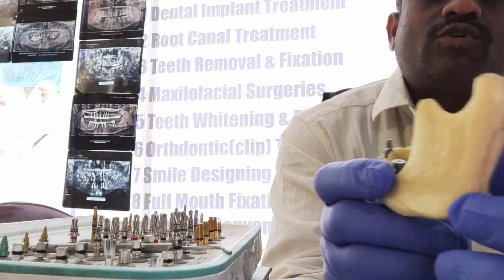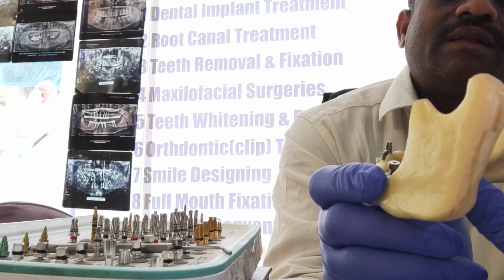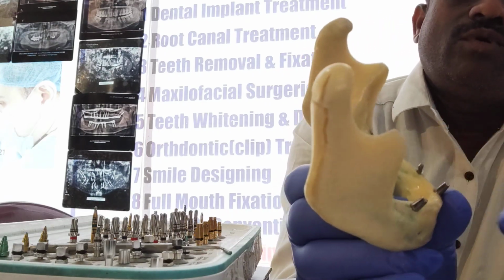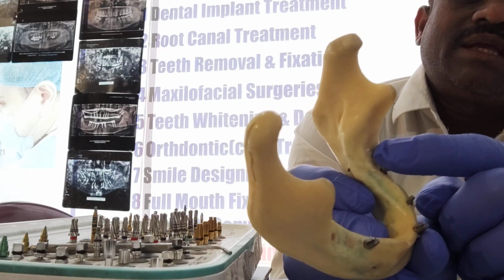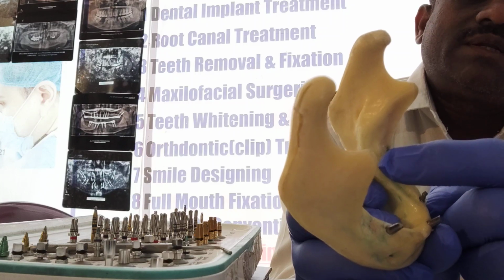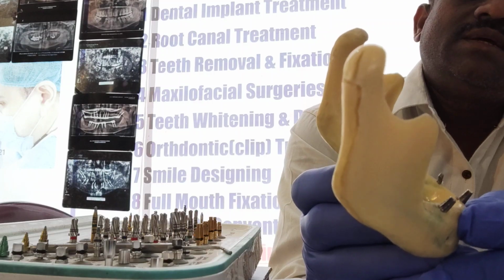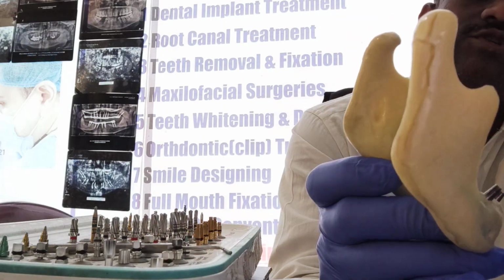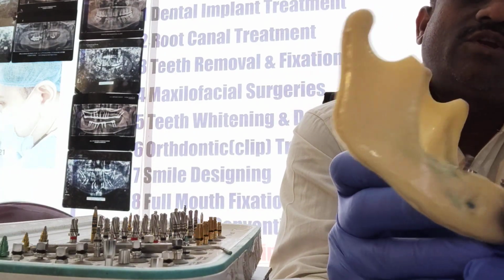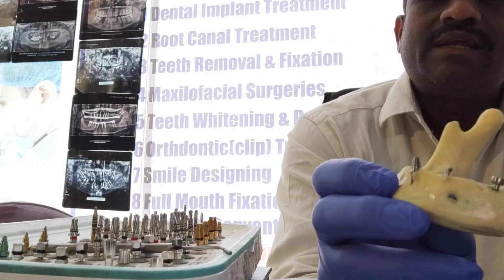That is the pterygomandibular raphe area. This is the mandibular canal. The inferior alveolar nerve enters through this mandibular canal. So the inferior alveolar nerve passes through this. Okay, in the molar area, the inferior alveolar nerve runs towards the lingual aspect in the third molar and second molar area, whereas in the first molar area it runs towards buccally. Since it runs in the lingual aspect, you have to be careful while placing the implant in the second molar and third molar area. So you can do the nerve bypass technique also. I have explained those nerve bypass techniques exclusively in my earlier videos.